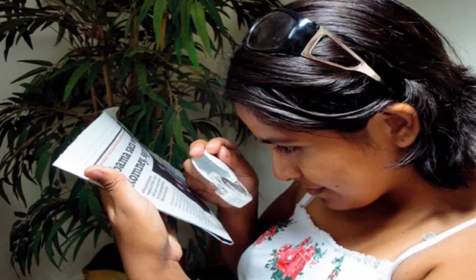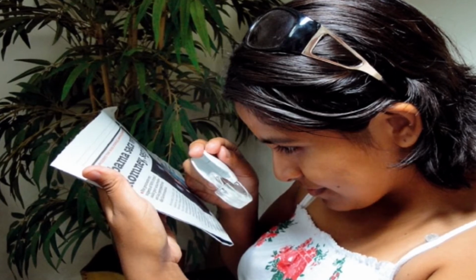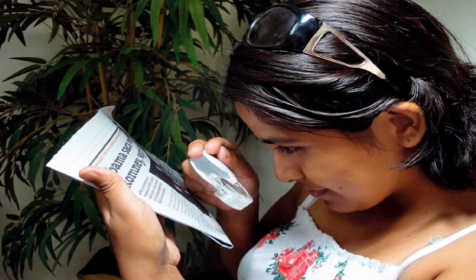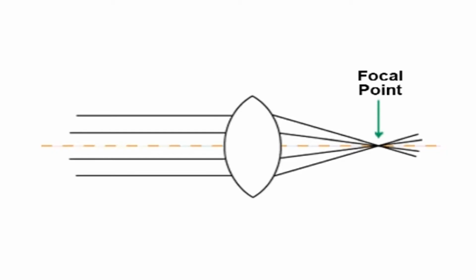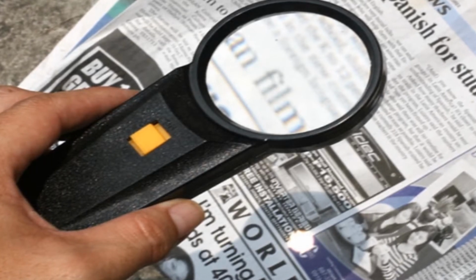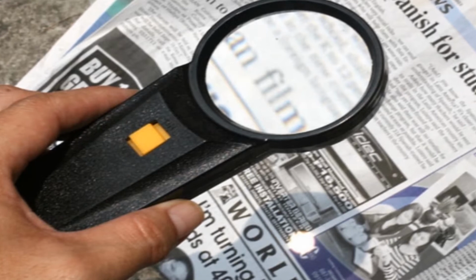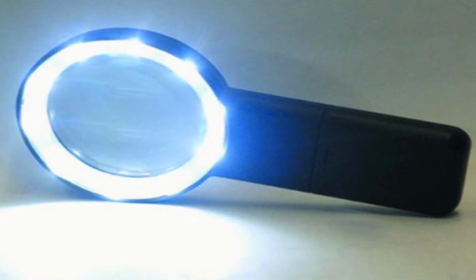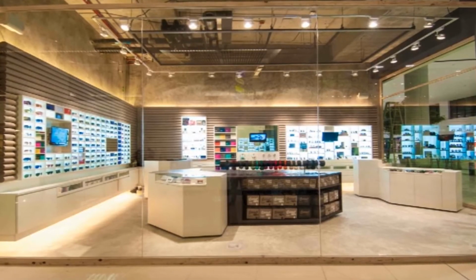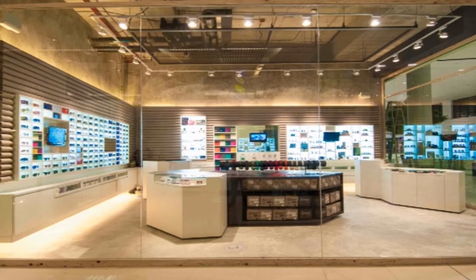Hand magnifiers are handy and easy to use. These are convex lenses mounted on a handle. It has to be used at the focal length of the lens. Higher the power, heavier is the magnifier. It is an excellent device for spot viewing and are available as self-illuminated and LED forms. These are inexpensive and readily available in the market.